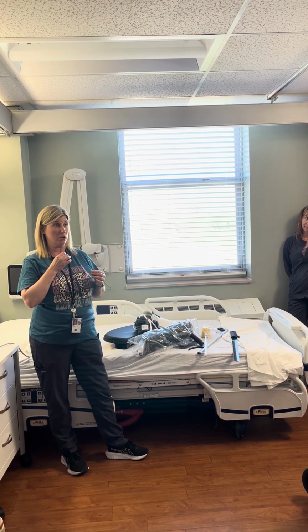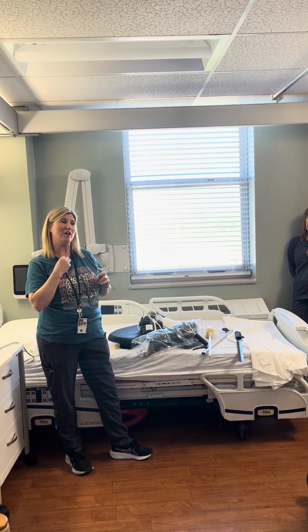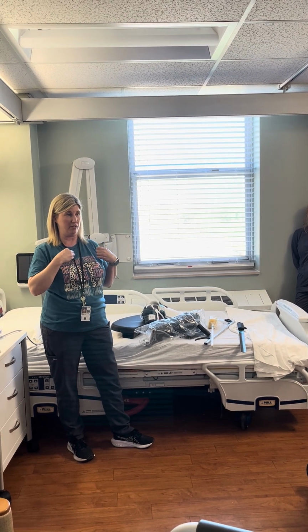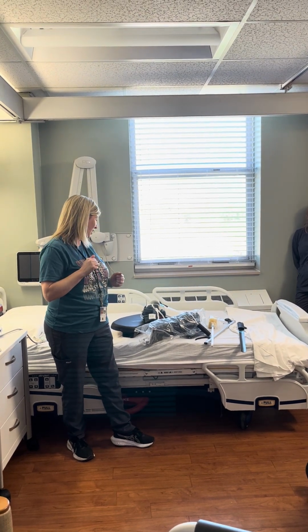With him, when I leave him in bed for his nap time, I'll hook it up here on the right side next to that top snap, and then pull it so that the cord's tight next to that little gadget that snaps. So it stays right there.